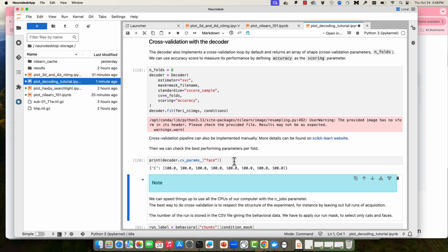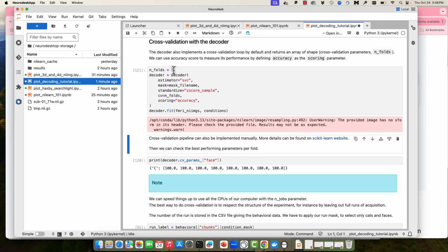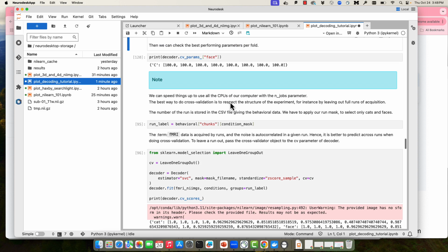Oh, I think I actually changed my number of folds. Do you have 3 or 4? You have 5? Sorry, no, that was me playing with it later on. Yeah, we're going to have 5 folds, and I'll show you where this is leading in just a second.